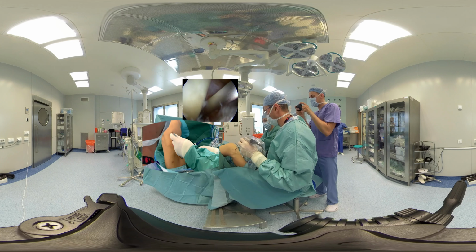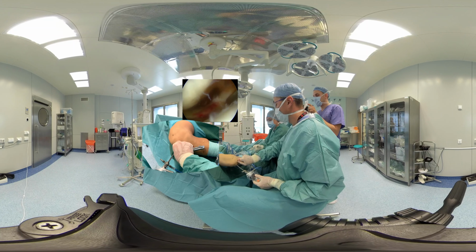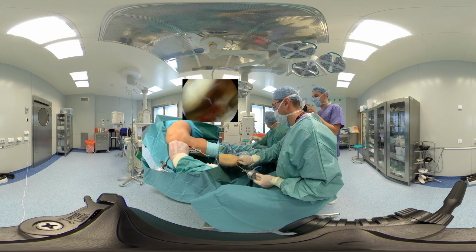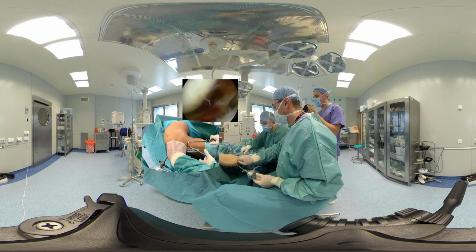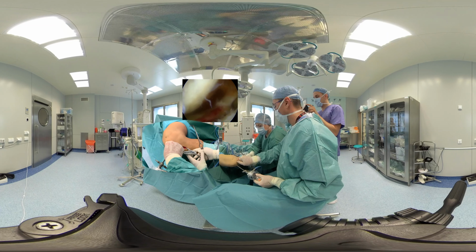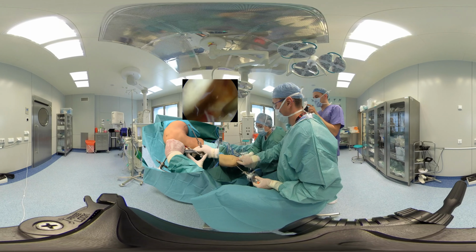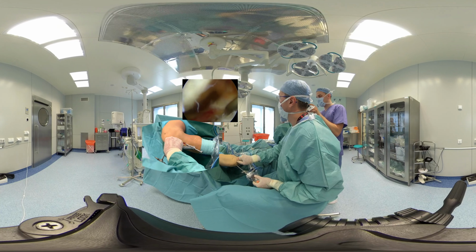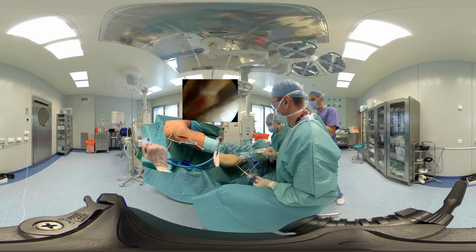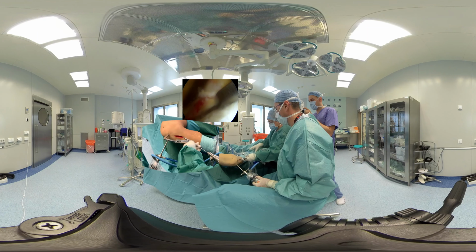The next step after the surgical access, incision is performed on the medial side of the tibia. At the level of the footprint, we put a drilling offset into the tunnel so that the hole in the knee joint is the place of the native root of the meniscus to the bone. We can see distal part of the ruptured ACL and distal part of the PCL. First, we drill with the passing K-wire.